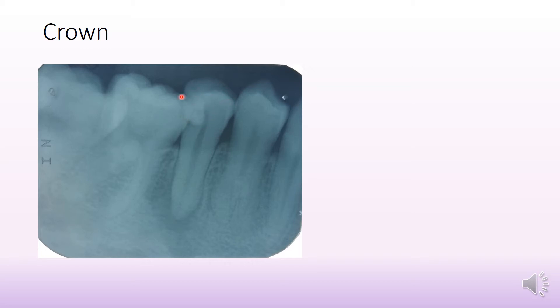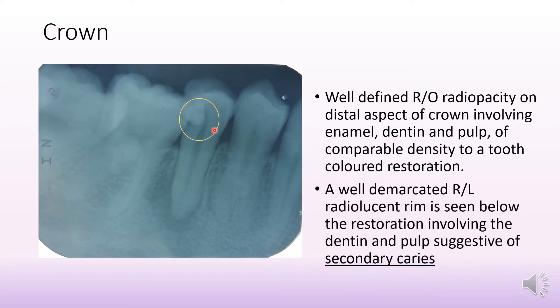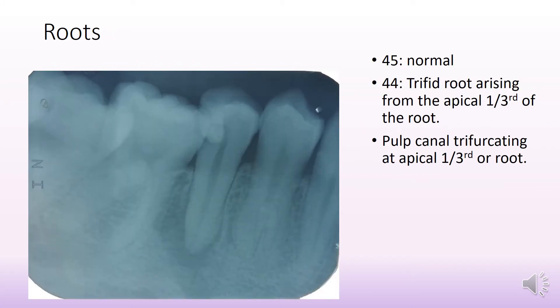Coming to the crown of the tooth, what is evidently visible is that in this area we see radio-opacity as well as radiolucency. There is a well-defined radio-opacity on the distal aspect of the crown involving enamel, dentine, and pulp, which is of comparable density to a tooth-colored restoration. Below the restoration we see a well-demarcated radiolucent rim, also involving dentine and pulp, which is suggestive of secondary caries.